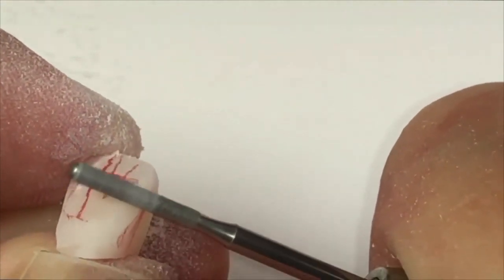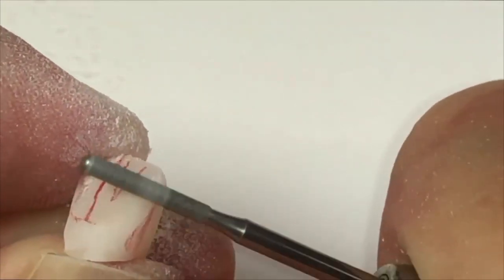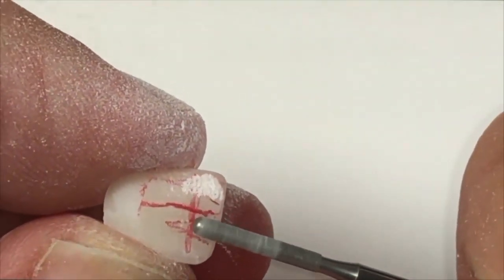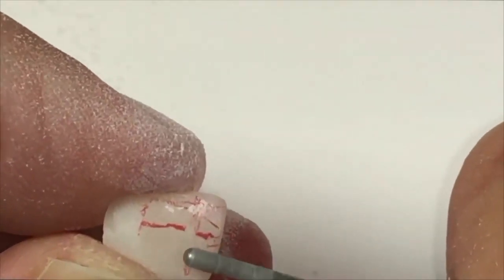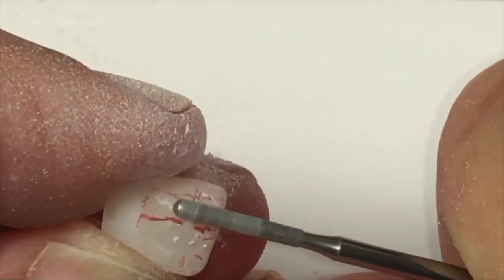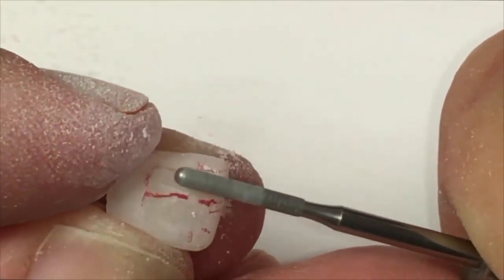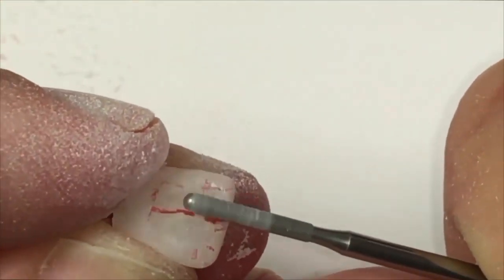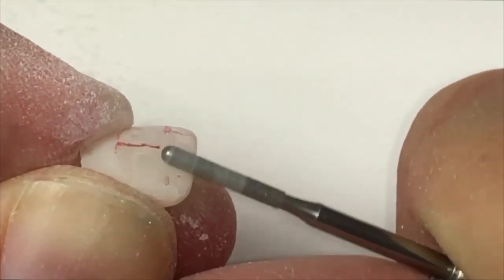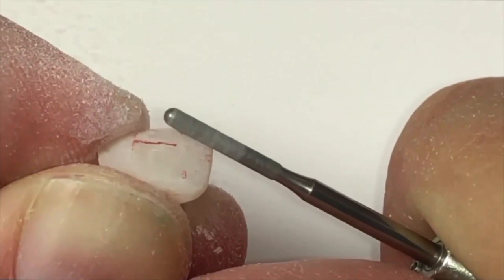The next step is to define the developmental depressions. It is important that you move with irregular movements in this area to prevent obvious ditching of the restoration. Finally, the incisal one-third is narrowed to flatten the incisal one-third and build some natural translucency into the incisal edge.